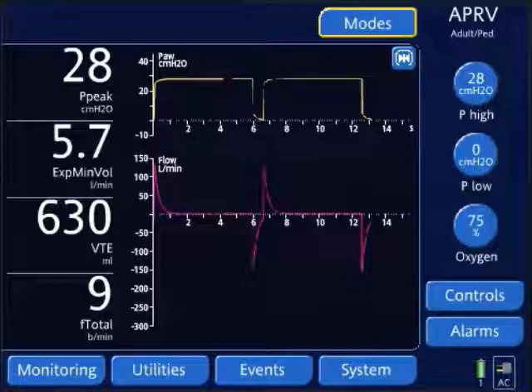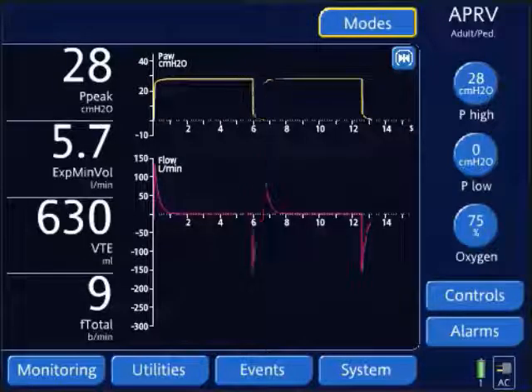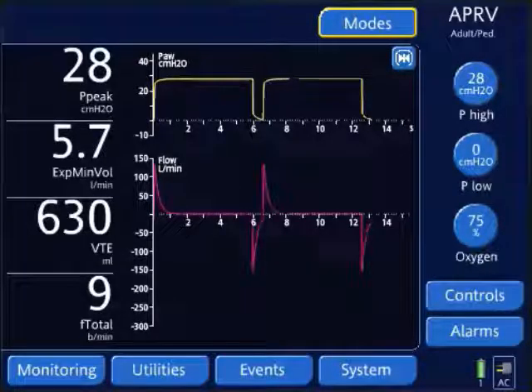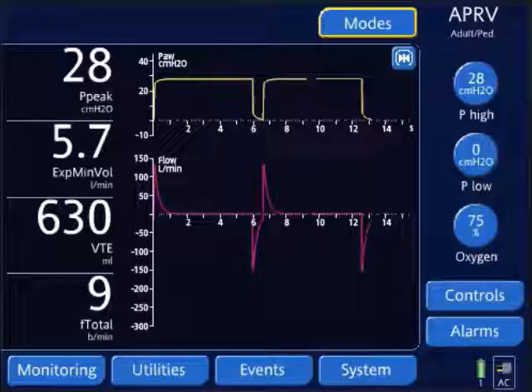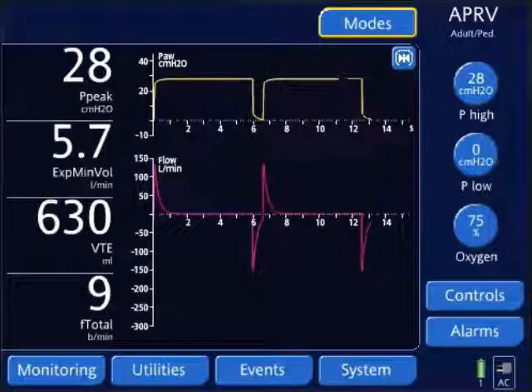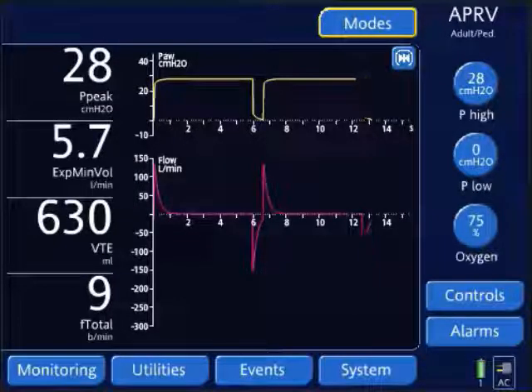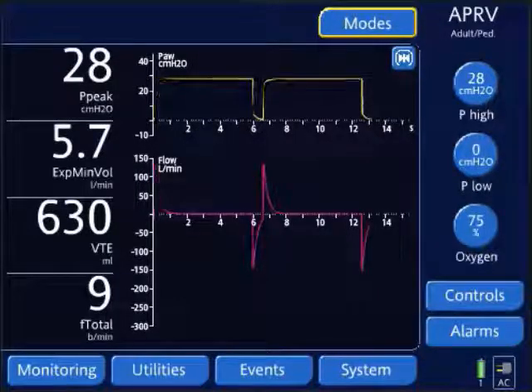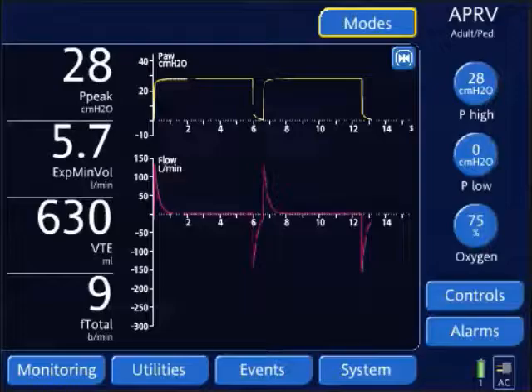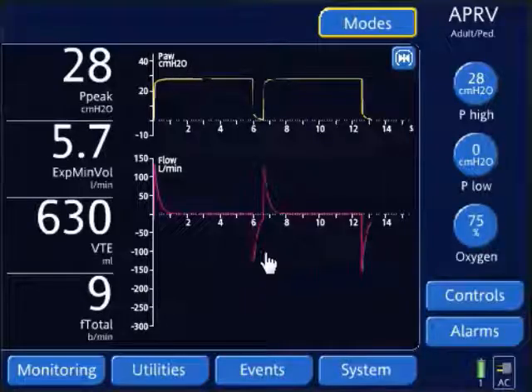One way to improve oxygenation during airway pressure release ventilation is to titrate the T-low. The first thing we want to do is assess the peak expiratory flow termination point.